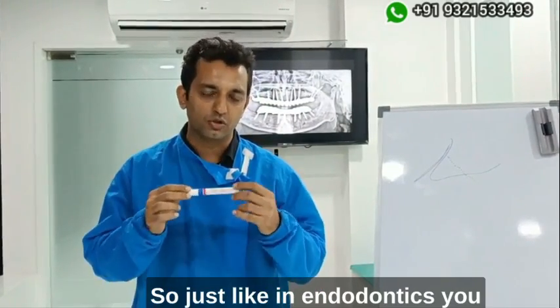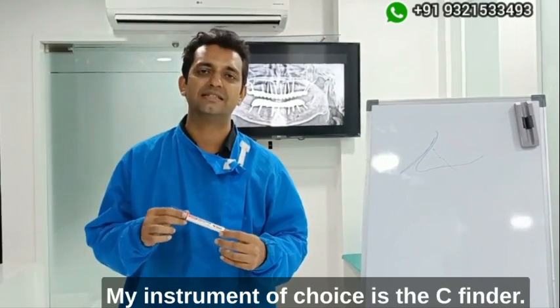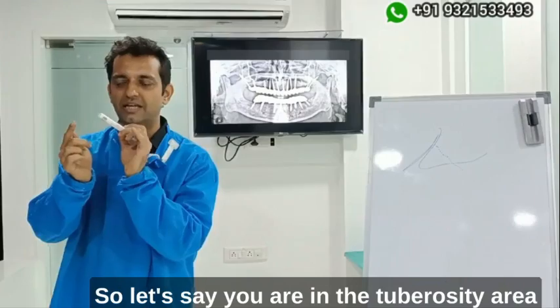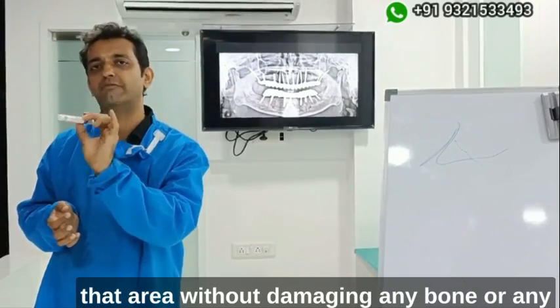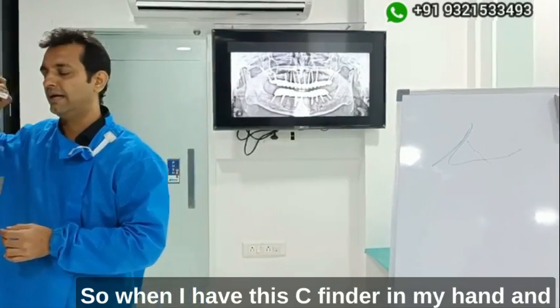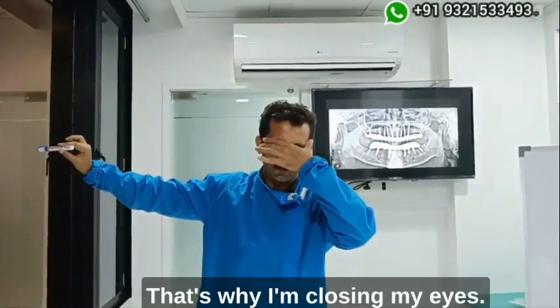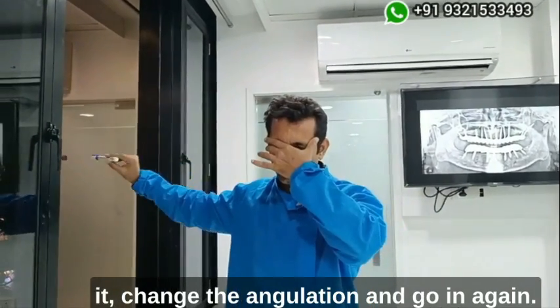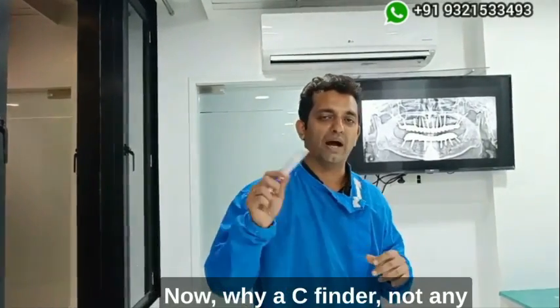We go from the tuberosity area into the fusion zone — that's the only thing we want to do in a pterygoid implant. The problem is that this is a blind procedure. Just like in endodontics we use a scouting file, here my instrument of choice is the C-finder. You go into the tuberosity area, and if you find no resistance, you retract, change the angulation, and go again until you find resistance. The moment you find resistance, your game is over.